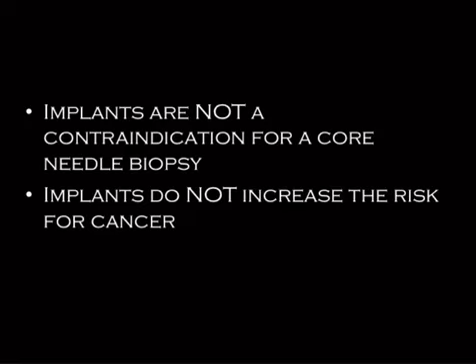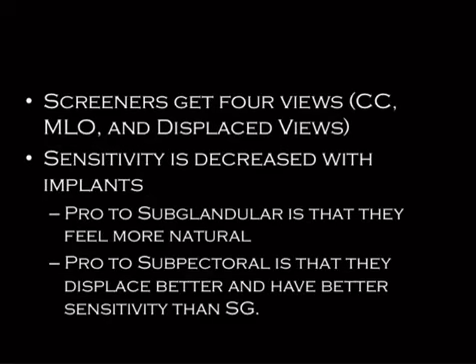There is not an increased risk of breast cancer with implants. This was a thing that people thought in the 80s or so. It's never been proven. Implants do not increase the risk for cancer. They do, however, make it more difficult to screen. So when you do screening mammography in the setting of implants, you get 4 different views. You get your standard CC view and your standard MLO view. But in addition to that, you get a displaced CC view and a displaced MLO view, and that's something the tech has to do where they try to push the implant out of the way and just image the breast tissue.